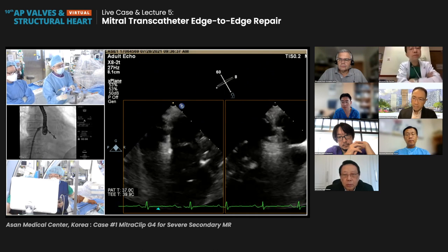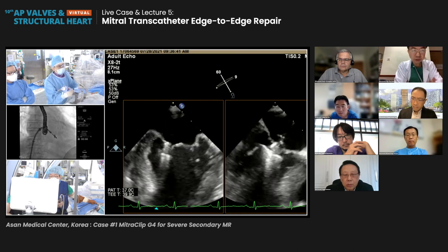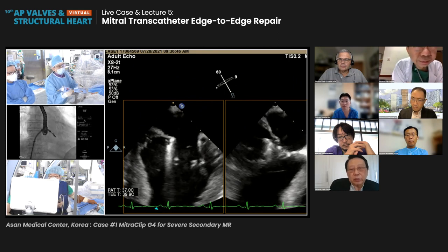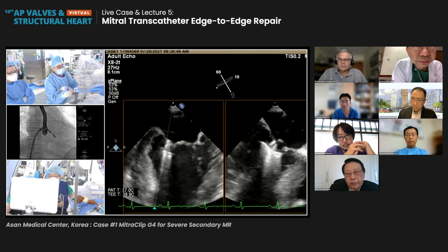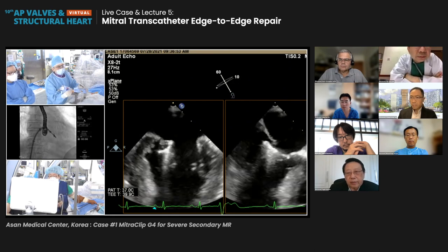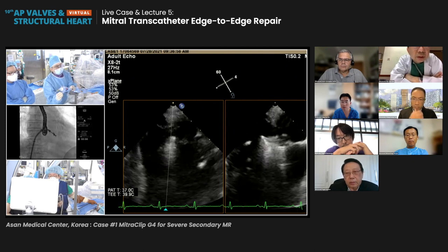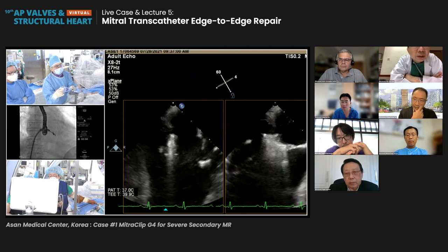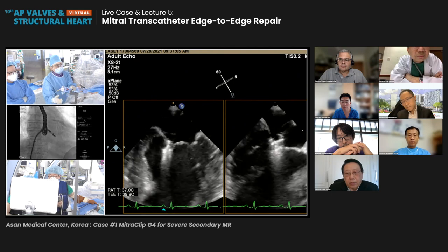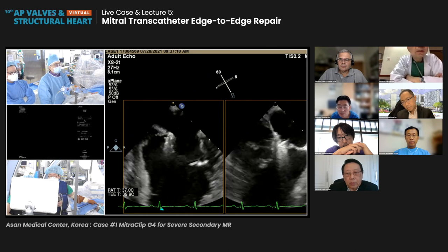Echo is very good now. Echo image is good now. Okay, best image. Do you think that you have enough anterior tissue? Oh, yeah, anterior is not. No, it's better. I think the anterior is caught. Anterior on the. How about now? Gripper is moving. Yeah, posterior is on the. Anterior is not fully captured, but I think.